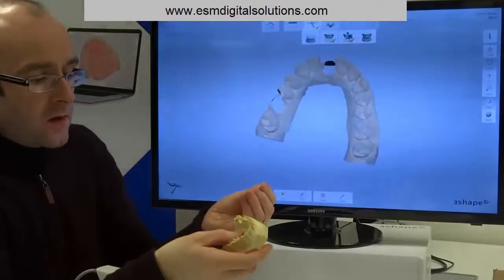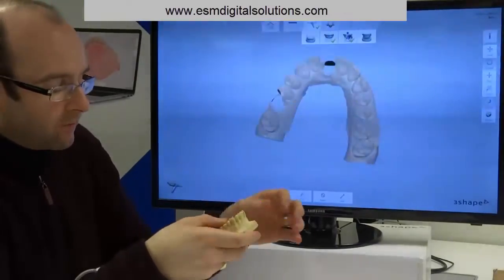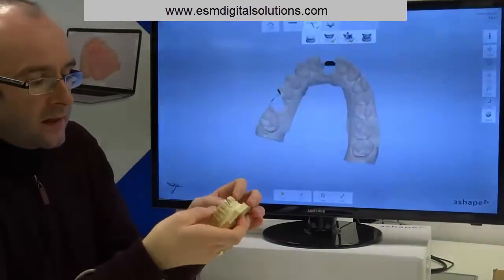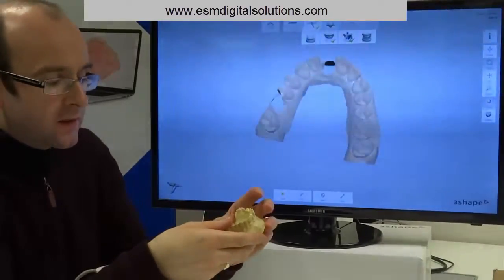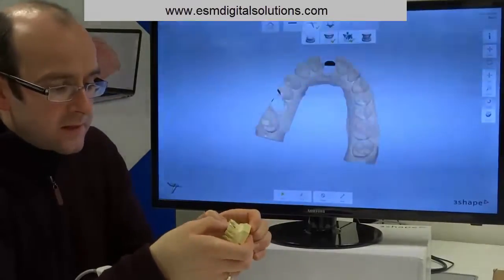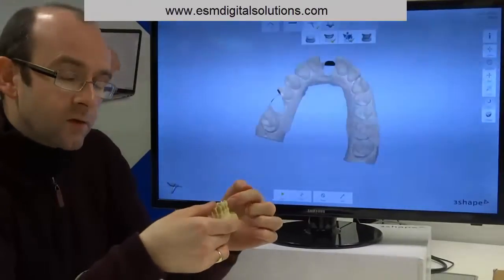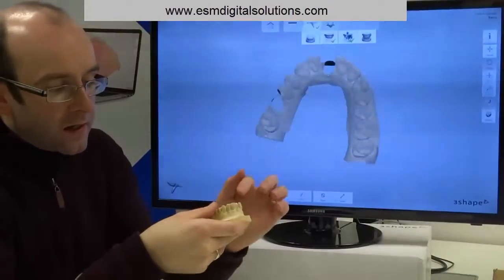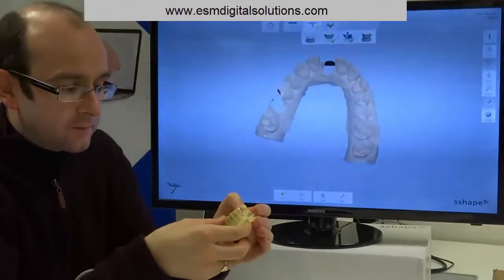At this point in the patient's mouth, we insert the scan flags. So scan flags are generally cylindrical posts which will have an indexing feature or a mating feature which will mate and engage with the fixture head. So we position the scan flags. In this case it's a taper lock system. The scan flags will generally have some flat or indexing feature on the surface. So in this case it's a cylindrical surface with a flat chamfer milled onto one side and a flat surface as well on the top.